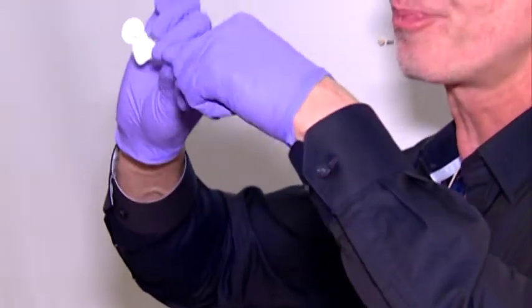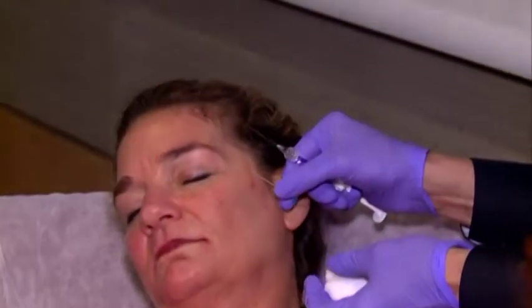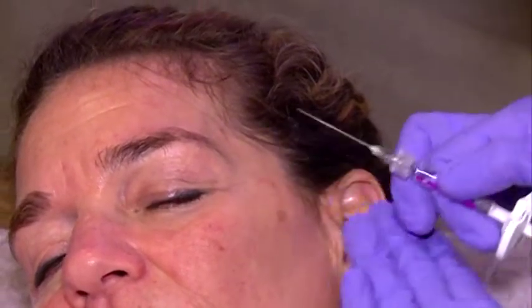Thank you. When you use the Belotero, this is glass, this is plastic. You hold the Belotero on the luer lock, and then you put the cannula into the luer lock system. See, no bleeding here still. Can I get a dry one? Dry gauze? And I do quickly the other side. You see I'm in here with my cannula.